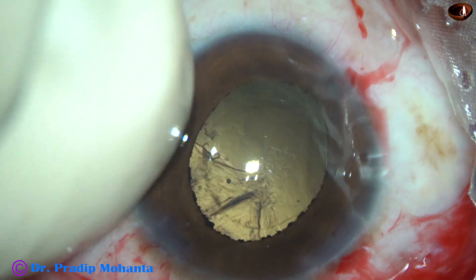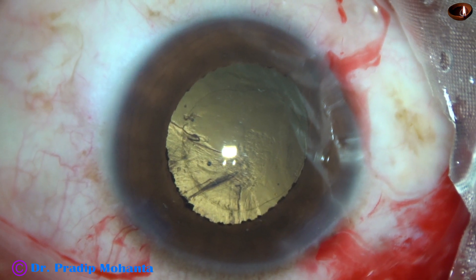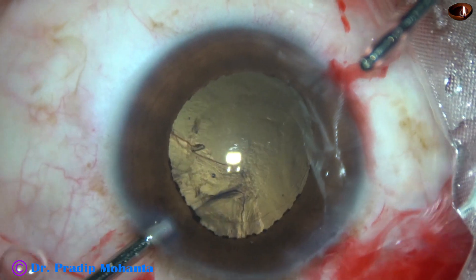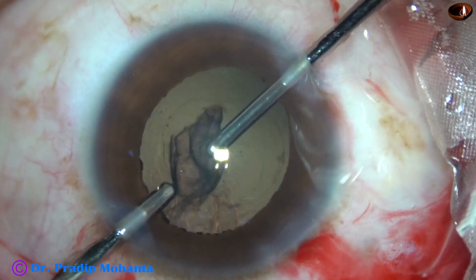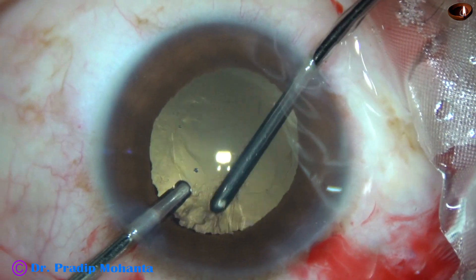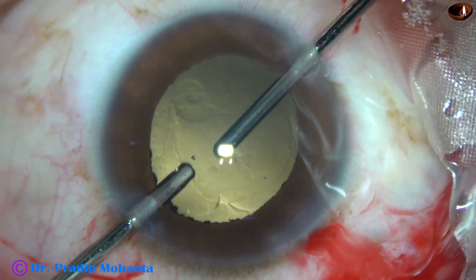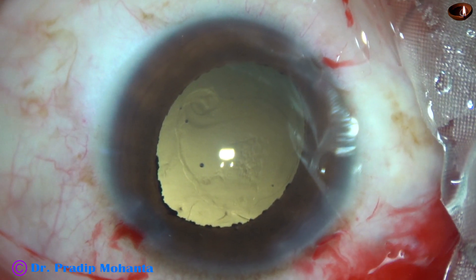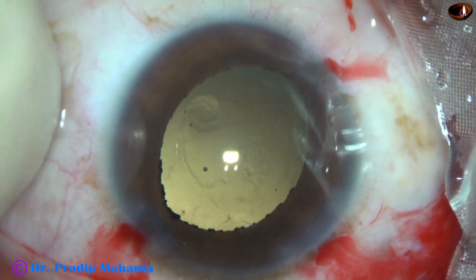This patient is having some fluid misdirection and the anterior chamber has become shallow, but still some depth is there to work on. The cortex has been nicely cleaned, and you can see the anterior capsular rim all around — the size of the rexis is about 4.5 to 4.75 millimeters.